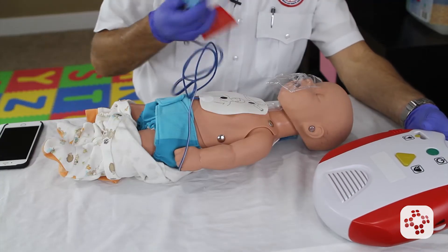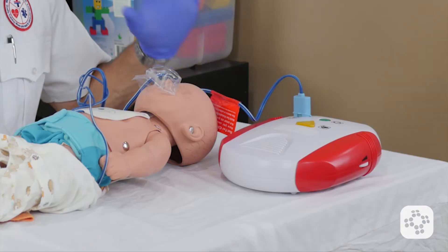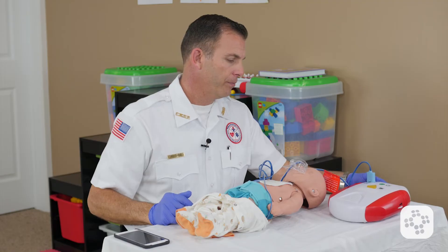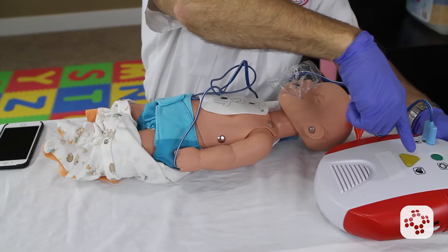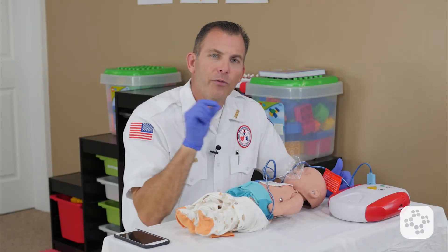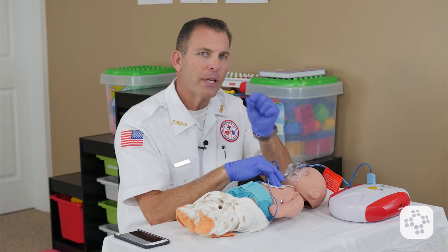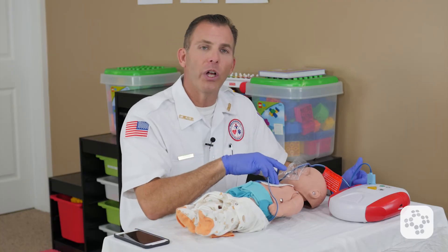Now the AED is prompting us to insert electrodes or connect the wires, so we plug it in and follow the prompts. At this point we wait for the AED to charge and then it encourages us to push the flashing button to rescue. Making sure we're not touching the patient, we push the flashing button. As soon as we've delivered the shock, it's vital to remember that per current research and guidelines, we don't want to delay the very first compression following the shock. We want to minimize that time gap to get pulse pressures back up and restore circulation of oxygenated blood as fast as we can.